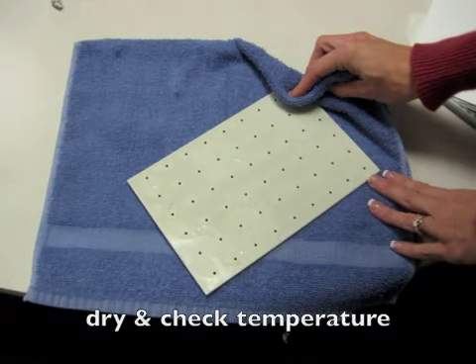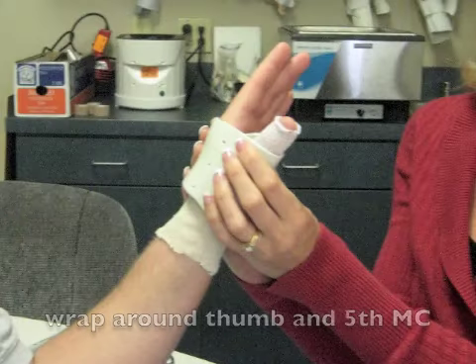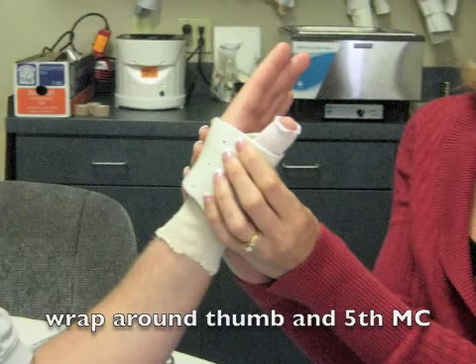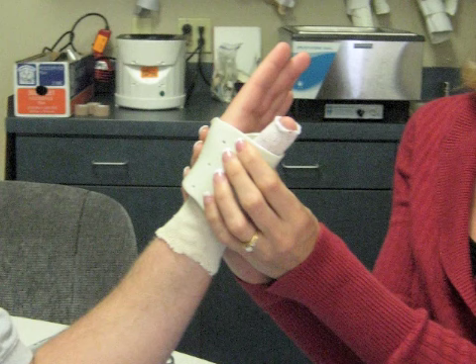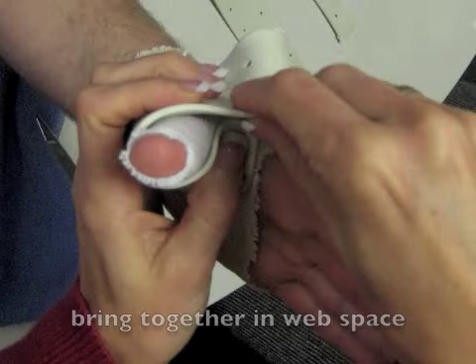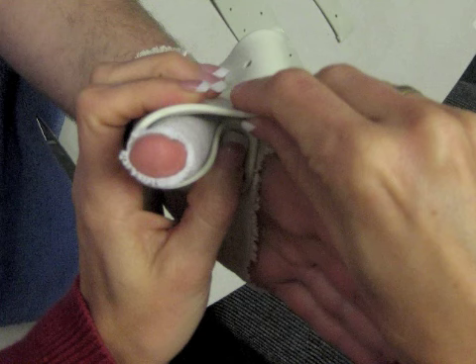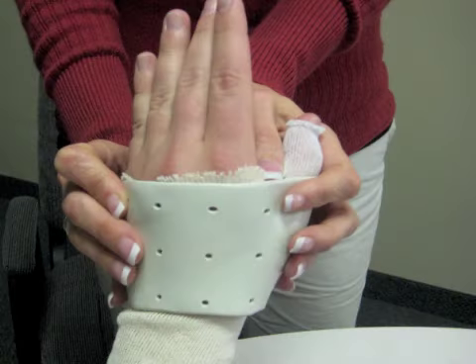Dry the material and test the temperature to make sure it is not too hot for the client's hand. Wrap the material all the way around the thumb and make sure that it joins in the web space between the thumb and the first digit. Then wrap around the fifth metacarpal. Press the material together in the web space and make sure that they are securely attached — superglue can be used if needed. Work with the material and form it around the person's hand. Try not to press down into the material with your fingertips, as this can make indentions that can cause irritation or skin breakdown.